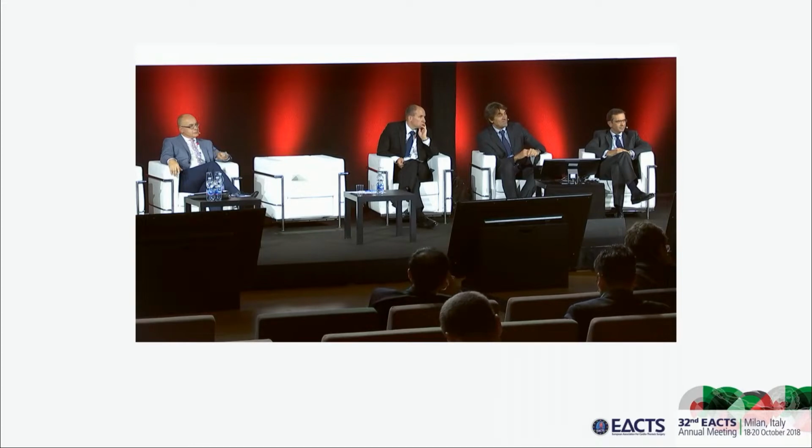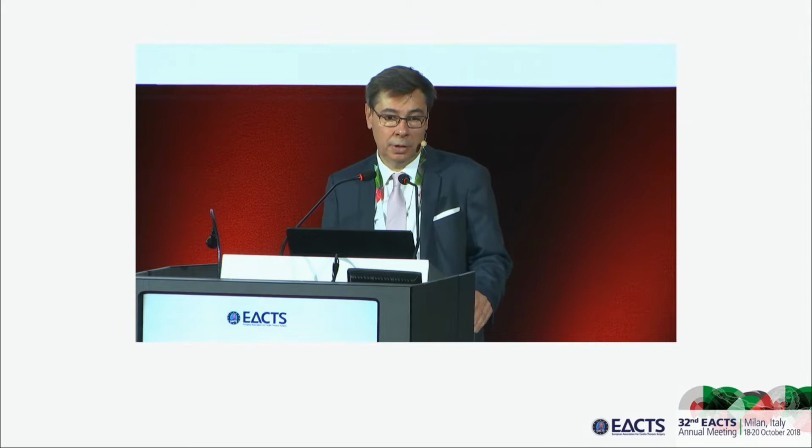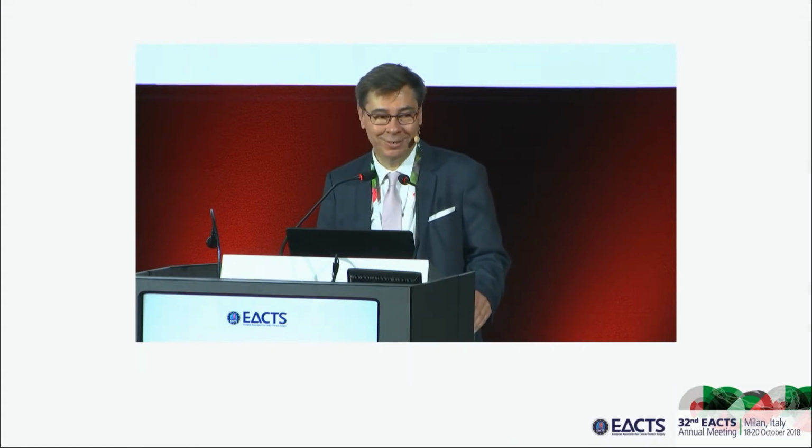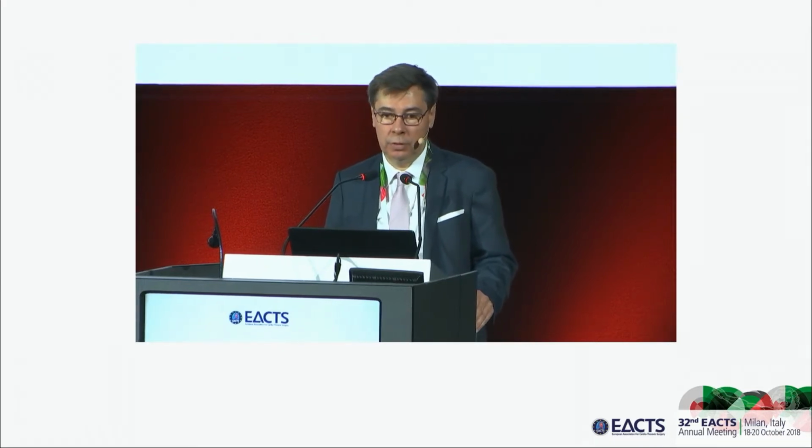But this is essential. This will help for the individual operation. This will also help us, if we do it systematically, to systematically improve our techniques. Michel, I assume you agree? I totally agree with you. Yes, not only the beautiful 3D images, but MPR is very important. It takes time, yes. Post-operatively, we also have to look at the patient, not only at the echo, but it's something that can help the surgeon both before and after repair.